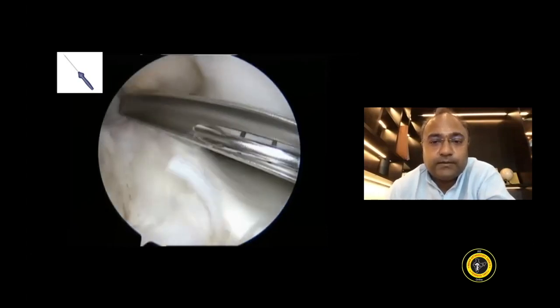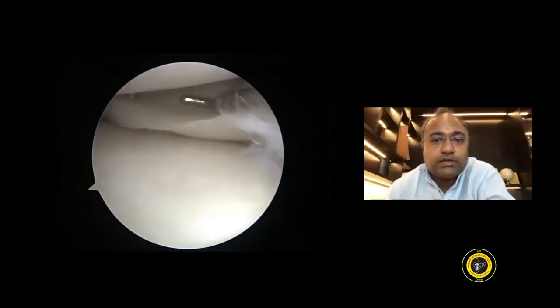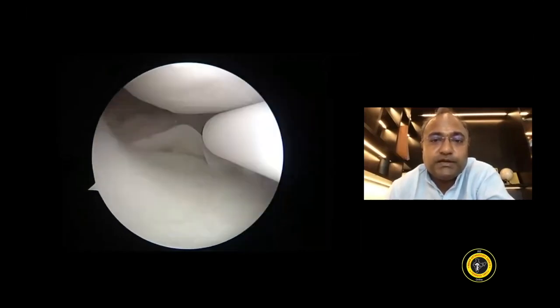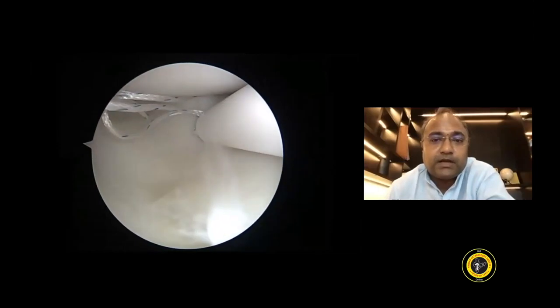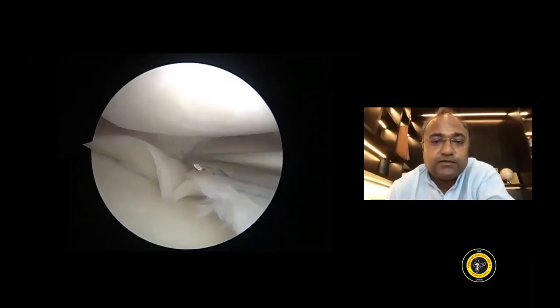to then progress with other modalities, which you will see ahead. Having done the posterior stitches using the lasso-like devices, and having got the capsular tissue to the level of the meniscus, now you can make sure that you repair the longitudinal component which is extending into the body. You can use simple devices like all-inside devices, ideally in a vertical mattress fashion, sometimes in a horizontal mattress fashion. If you want to span a larger area, first tie the superior surface.